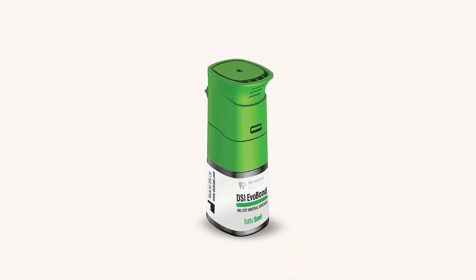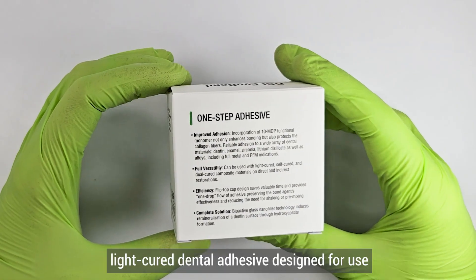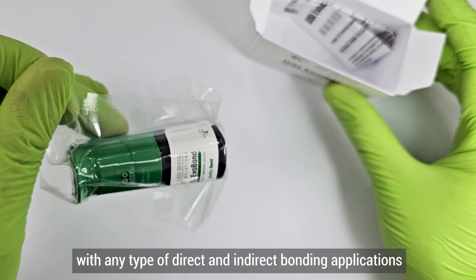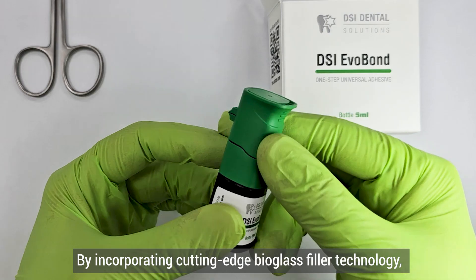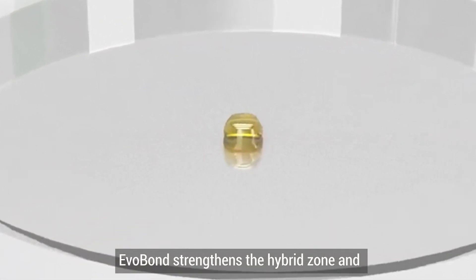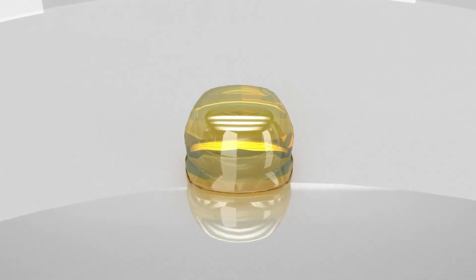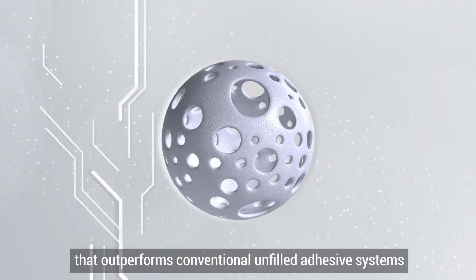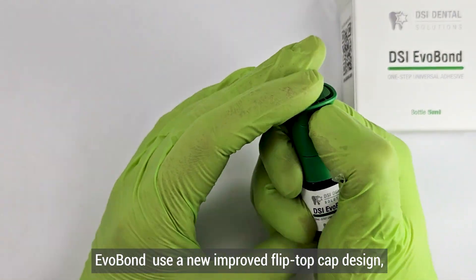DSI EvoBond is a truly universal single-component, light-cure dental adhesive designed for use with any type of direct and indirect bonding applications. By incorporating cutting-edge bioglass filler technology, EvoBond strengthens the hybrid zone and deeply permeates dental tubules, providing exceptional bond strength that outperforms conventional unfilled adhesive systems.